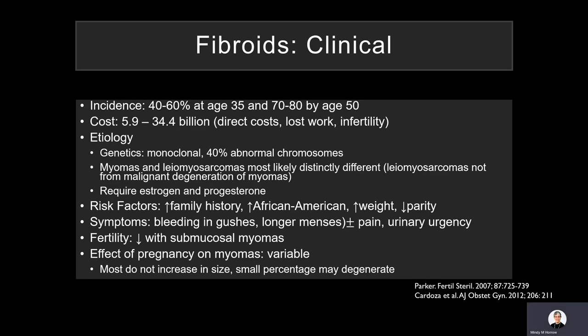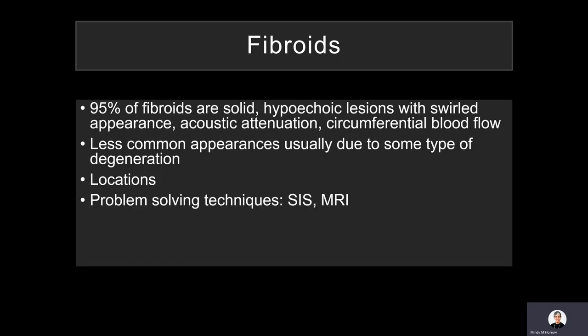Pregnancy itself doesn't usually affect fibroids, though there may be some degeneration. On ultrasound, the vast majority of fibroids are pretty typical — solid, generally hypoechoic compared to the myometrium. There are a variety of less common appearances that we'll discuss, because they can appear rather odd and cause problems with diagnosis. It's also important to note their location, and we'll discuss some problem-solving techniques.